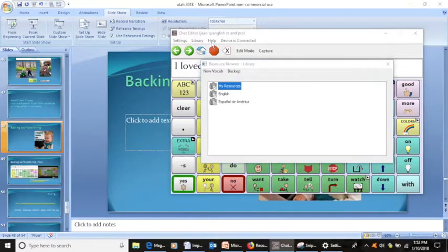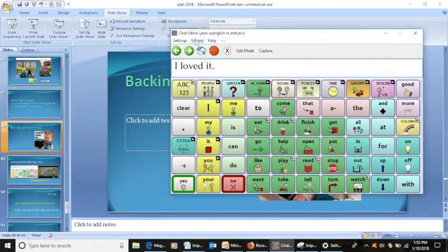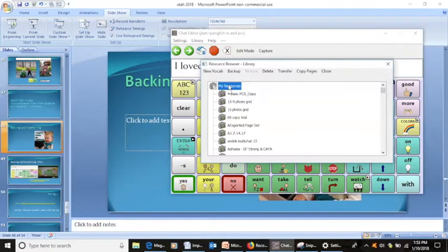You can disconnect this and go back over here. Welcome to NovaChat. Go back over here to the library and go to my resources, and Christine is right there.